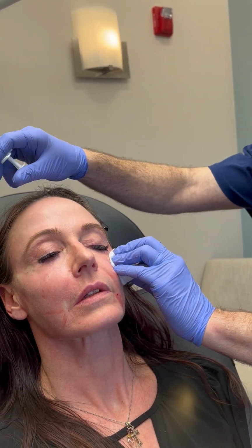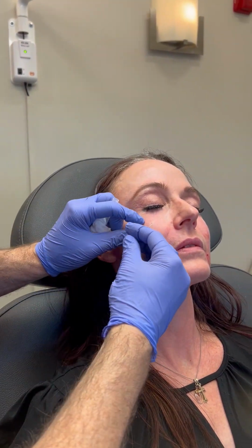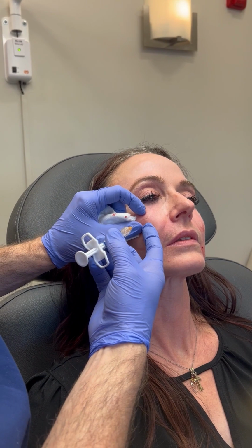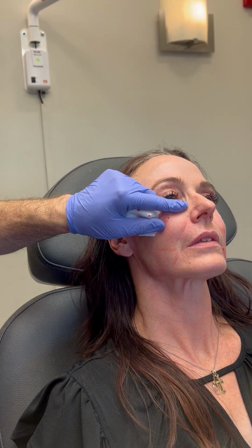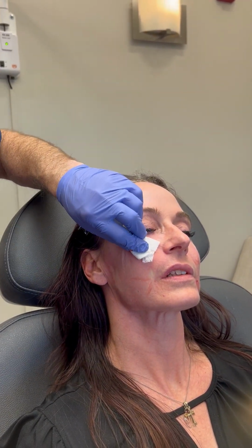Good. And then the same thing on this side. We'll start here and just be very gentle. She doesn't need much, and too much will make it look puffy and swollen. So we want to just be real gentle here. I'm going to fan it a little bit. And then lastly, we will do the lateral. Good. And we'll go ahead and we'll do this here.